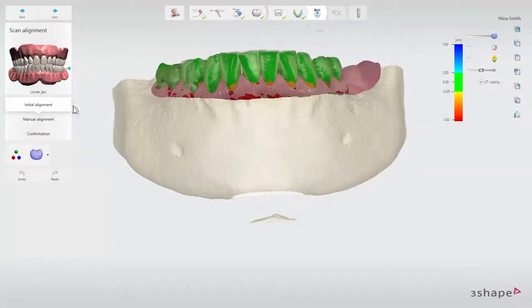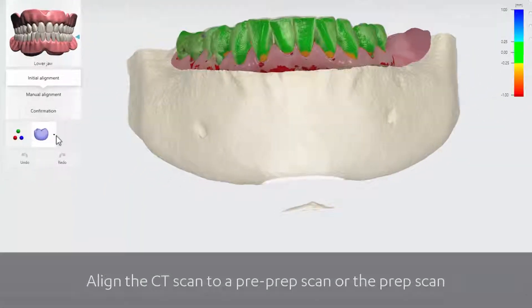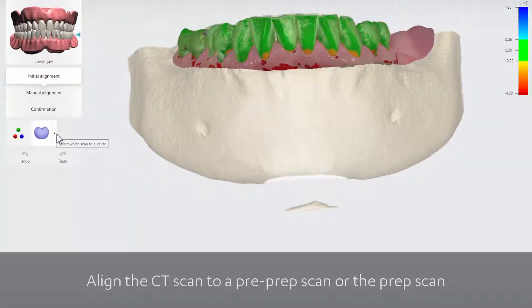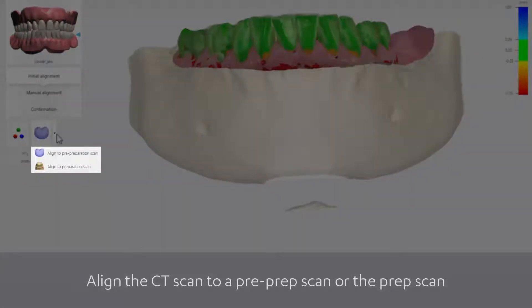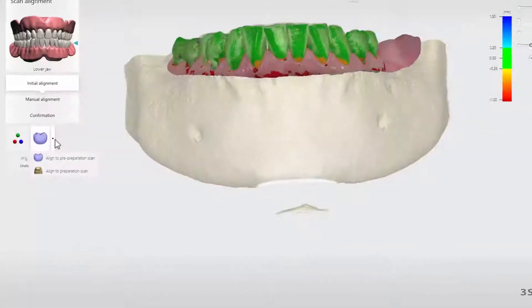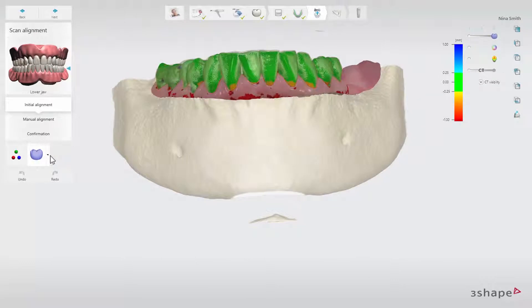If you also included a pre-prep scan on the order, you can choose whether to align the CT scan to the pre-prep scan or to the prep scan. The software will automatically change the alignment for you. These new scan alignment features are available in 3Shape Implant Studio 2017.